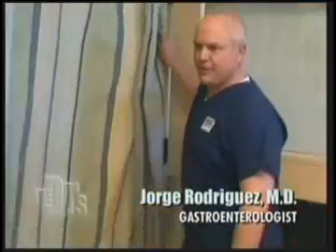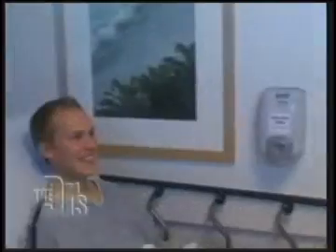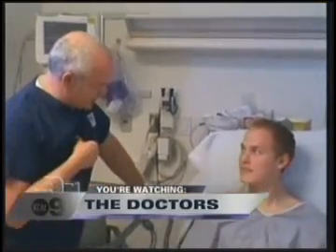Hey Jacob, how you doing? Good. Yeah, you're nervous for today? Yes. A little bit? We're going to be passing a tube with a light down into your stomach, and then I'm going to suction a little chip around the size of a bean into the esophagus.